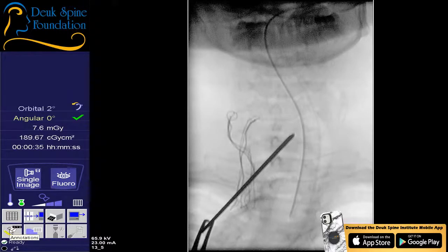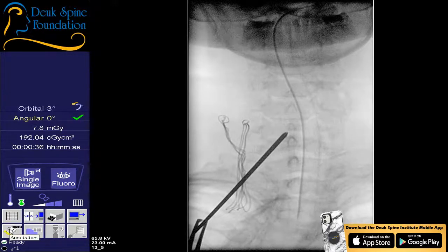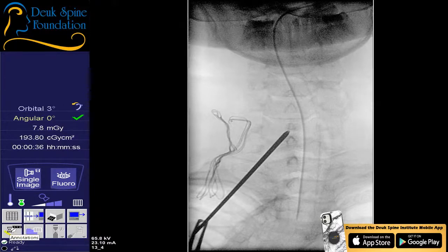All right, so we're off to the side. I need you to line that up in the middle better. Shot. That's better for both of us. It's a little slippery. Shot. Lateral. Get the mallet ready. I need a lateral.